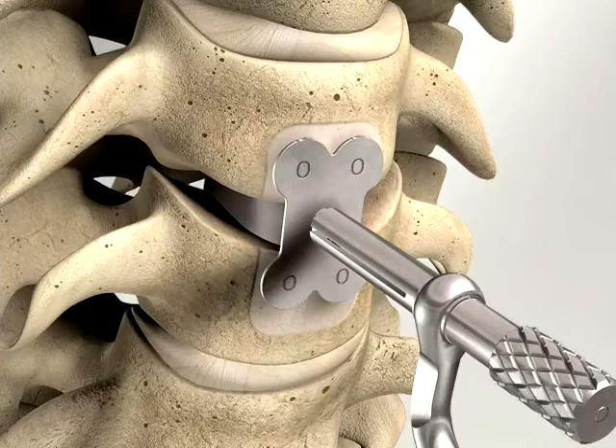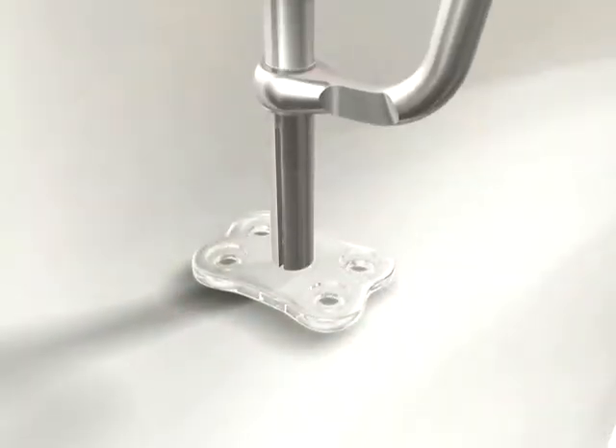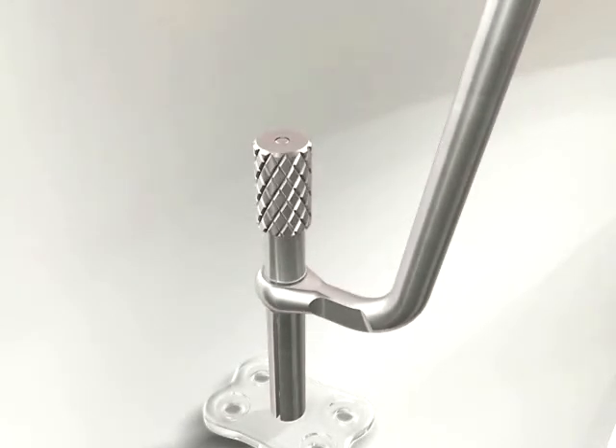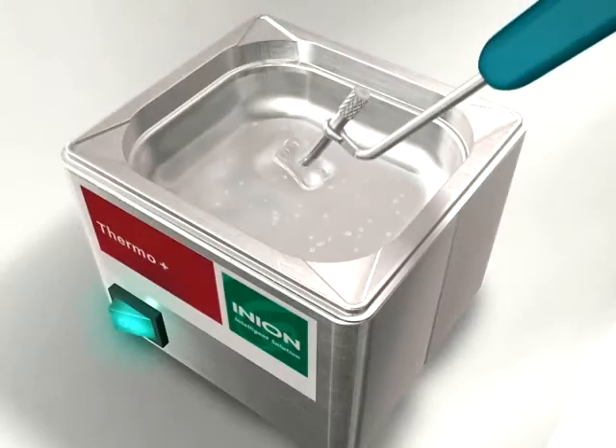The correct size plate is attached to the plate holder by positioning the distal end of the plate holder in the middle hole of the plate and gently tightening the screw on the plate holder. The plate's countersinks must be proximal to the surgeon. The plate can then be easily contoured using the water bath treatment with the plate attached to the plate holder.